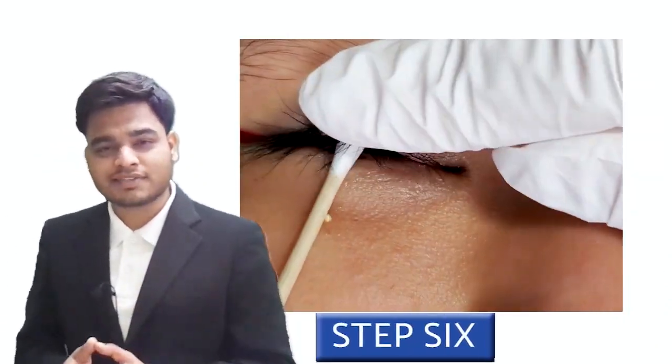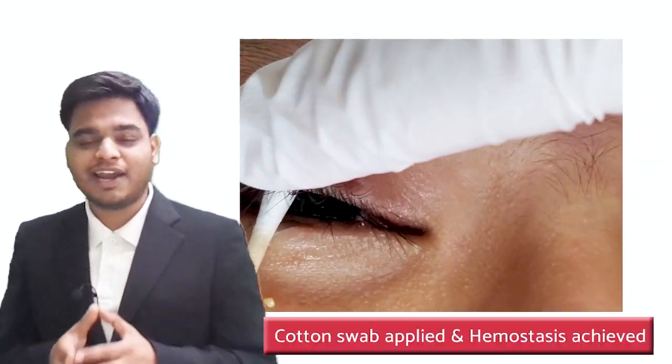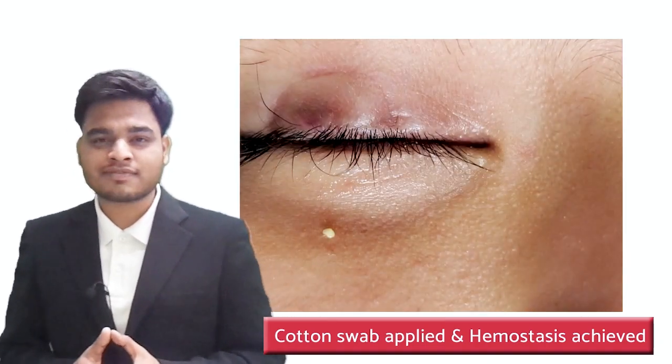Step number six: a cotton swab is applied under the eyelid and the chalazion clamp is removed to achieve hemostasis.